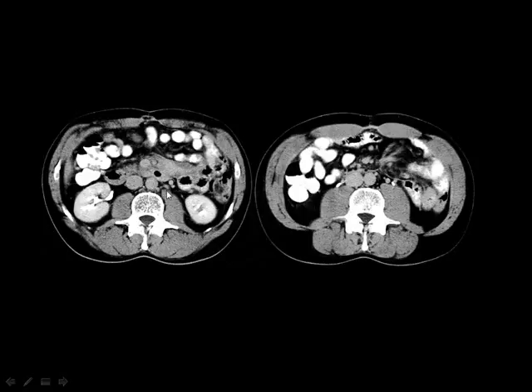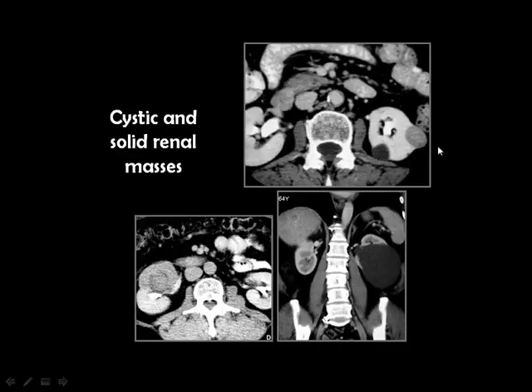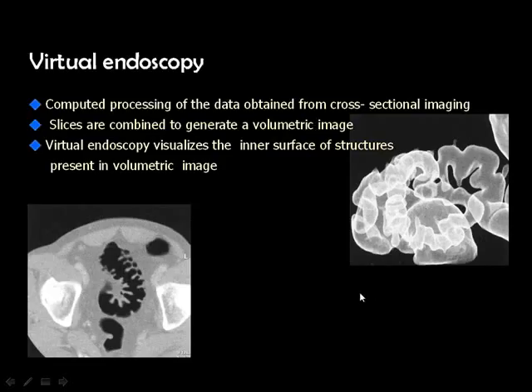The ureter is intermittently visible on CT due to peristalsis: at the time of a peristaltic wave you don't see it, and during relaxation you can. In the kidney, as with the liver, cystic masses are benign and solid masses are malignant. A simple renal cyst is an example of a cystic mass, and renal cell carcinoma is an example of a solid malignant mass. Both lesions can coexist in the same kidney and are easily discriminated based on density.